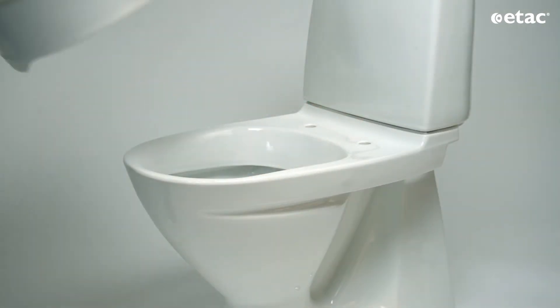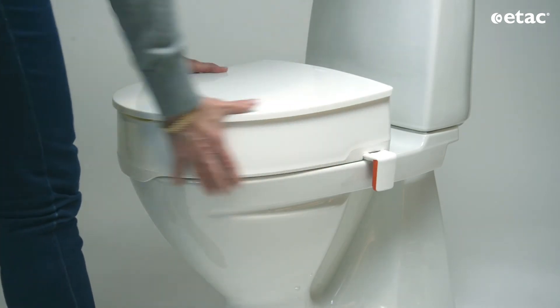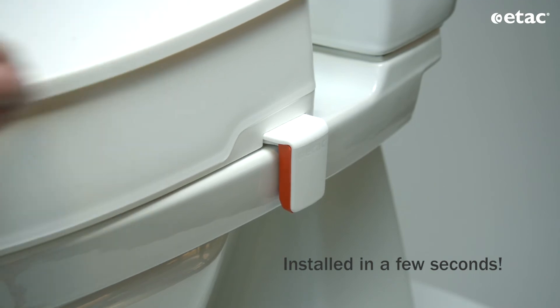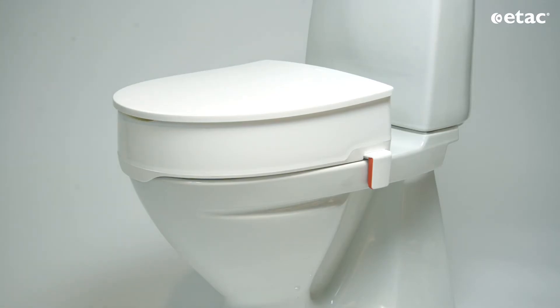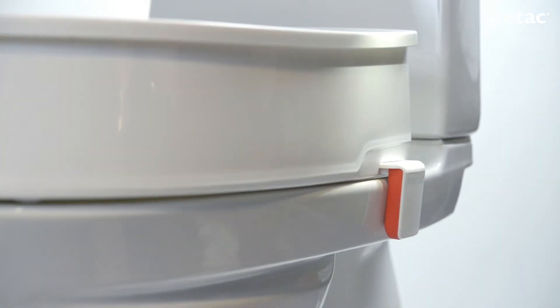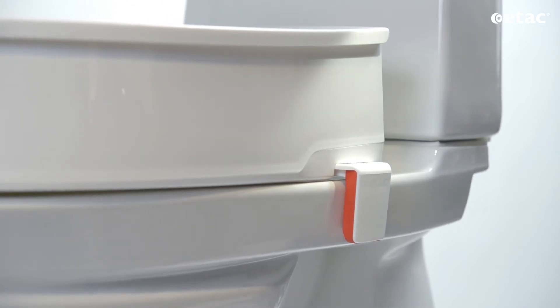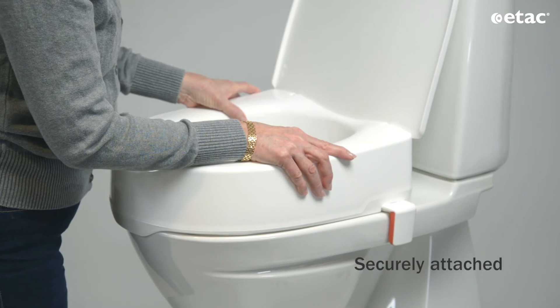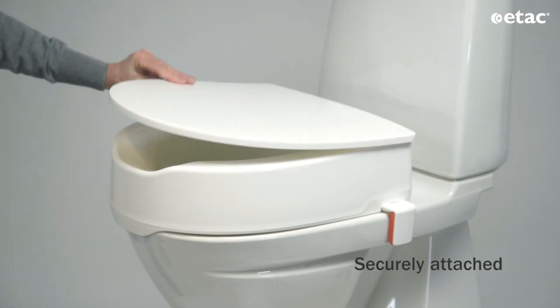Put the seat on the toilet, then press both brackets at the same time. Click — the installation is done. The extra large friction surfaces and flexible material of the brackets ensure a firm attachment to the porcelain and adapt well to different toilet shapes.